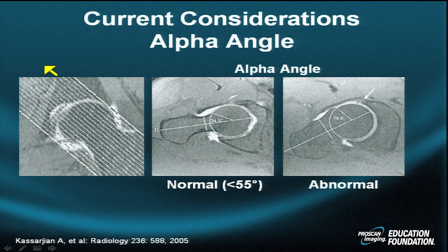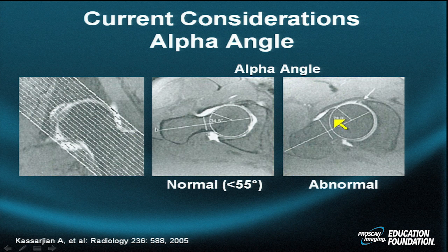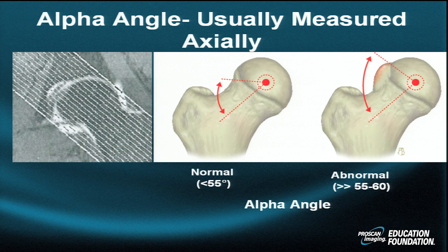Here's another way to acquire alpha angle measurements: you can get an oblique axial or para-oblique off of a coronal and make the same measurements bisecting the long axis of the femur. The second angle is made at the femoral head-neck junction where there is normal tapering. In the normal state the angle is well under 55 degrees; in the abnormal state due to the bump, the angle widens and approaches 90 degrees. Not everyone with an abnormal alpha angle will have symptoms of FAI — you must take the full clinical syndrome into account, along with secondary signs such as labral pathology, anterior hyaline cartilage erosion, effusion, and contre-coup injuries.